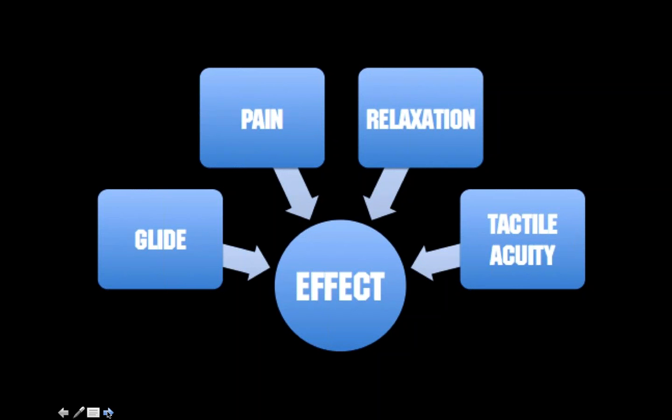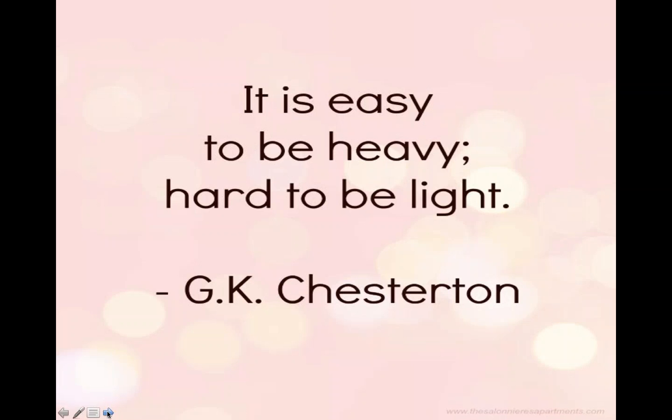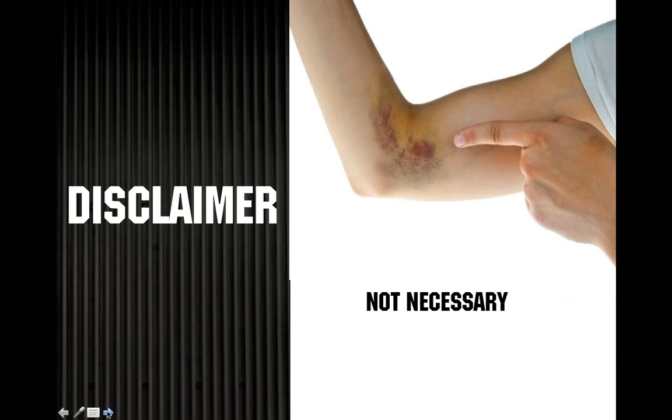Our dry technique is not using any emollients, and we'll take the tool at various angle and depth, and we'll drag it along the tissue to increase some glide. And the only way we know that is post-testing. Does it look like it moved better? So again, this idea of petechiae over an area we feel is not as necessary as it is to mitigate pain and increase fascial gliding amongst the system.